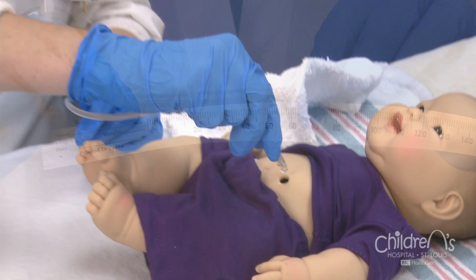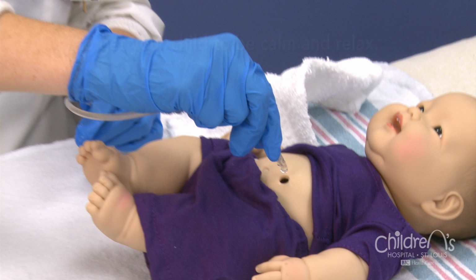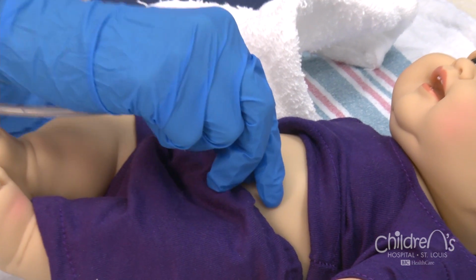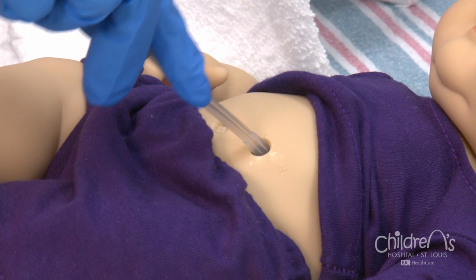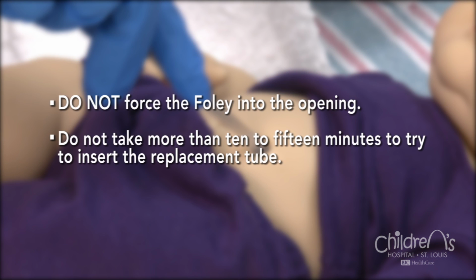Your child may cry, wiggle, or kick, which can cause the abdominal walls to tense. Try to relax and comfort your child. When your child breathes out, the abdominal muscles will relax and the Foley catheter should slide into the opening. It is important to remember not to force the Foley into the hole. If you are unable to get the Foley catheter in, try the next size smaller. Do not take more than 10 to 15 minutes to try to insert the replacement tube.